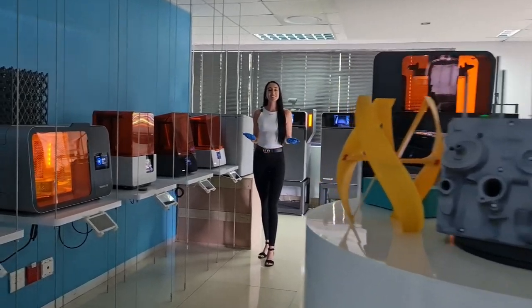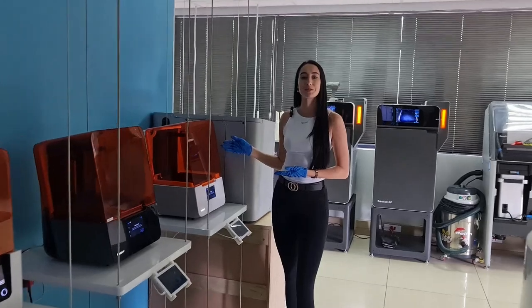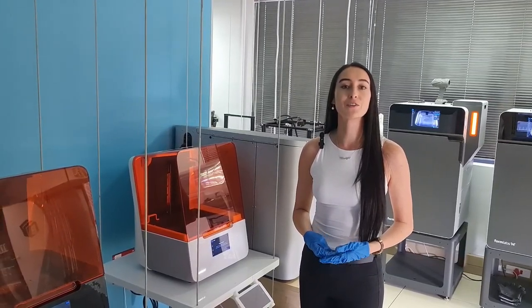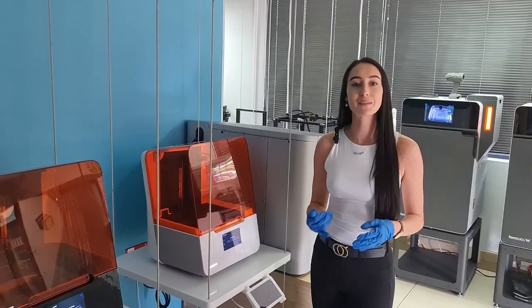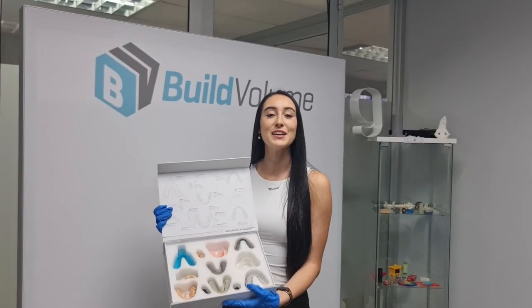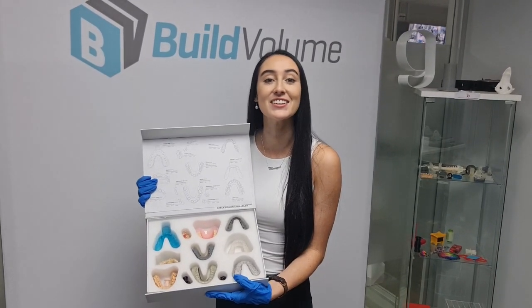So what exactly is 3D printing? 3D printing is the process of creating three-dimensional objects from a digital file using a special type of printer that can materialize objects using plastic filaments, UV curable resin, or even metal and nylon powders. It's being used more and more in dentistry to create things like dental implants, crowns, bridges, and even dentures.